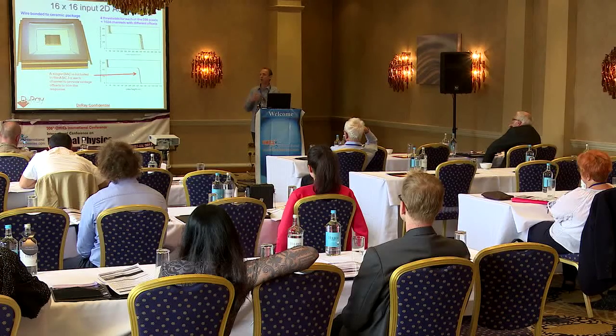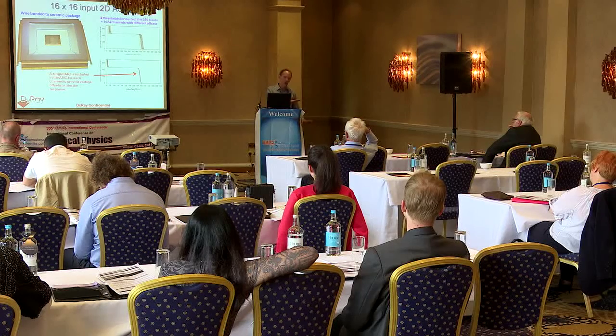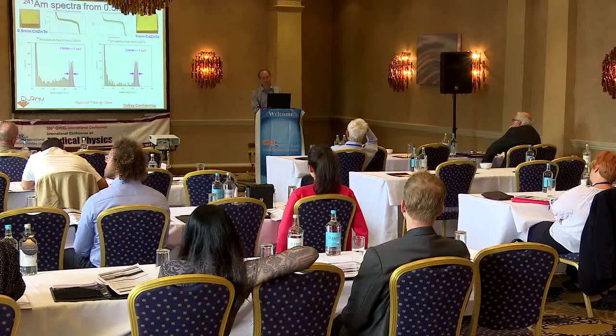They have no dark noise, meaning that there is no signal if no X-rays are present. And that's important for very low dose methods where we are pushing down the intensity to near where the dark current is in regular integrating detectors, and then that becomes a problem, and that problem is eliminated with the photon counting method.